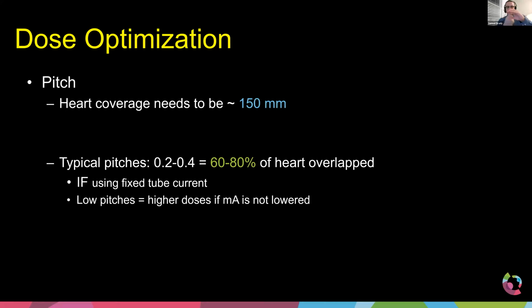So it's important to know the way we reconstruct that and when the x-ray tube is on as it's beating through that, we'll talk about in a second. But if you're setting the mA such that the system will change the mA, the tube current modulation, as it spins around the body, because obviously we're imaging the heart here, but that's going to be passing through a larger, wider aspect of our bodies laterally versus anterior to posterior. So if we do tube current modulation, then remember, dose and pitch are separated. You can have low pitch and high pitch, and you can have the same dose output.